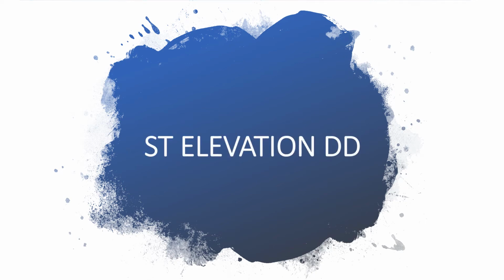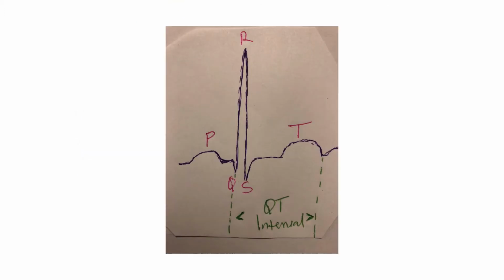Today I'll be going through possible differential diagnosis of ST segment elevation. Here I have a small sketch of electrical activities starting with P, Q, R, S, then the T. But here should be the J point.